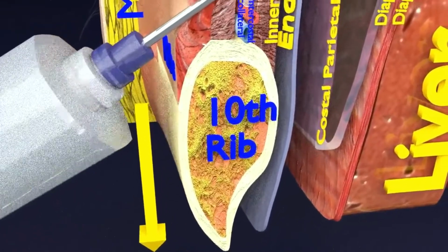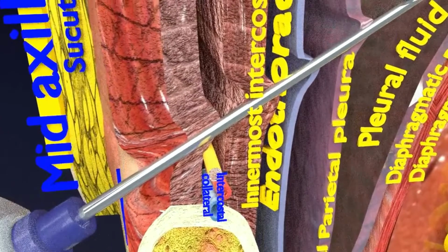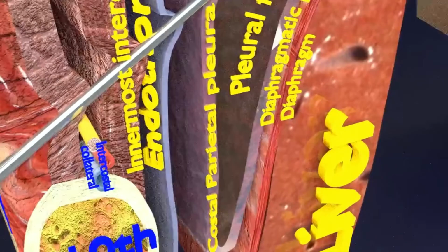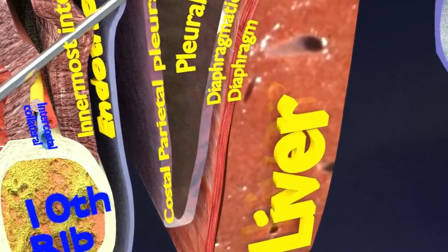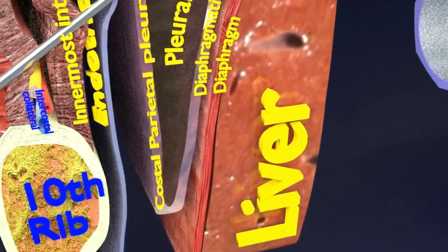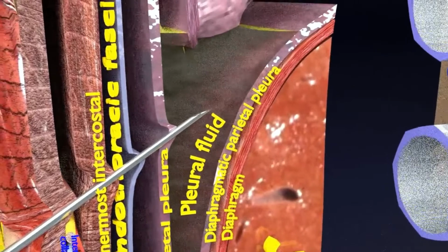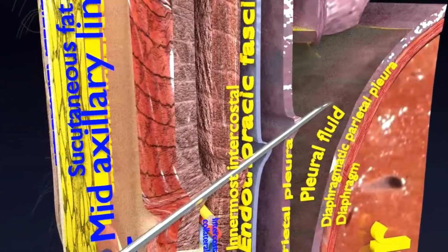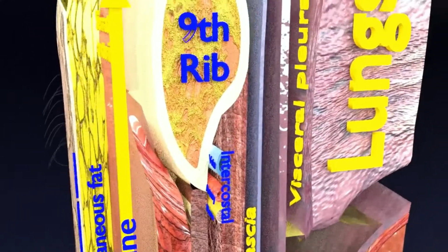To start with, usually an imaging test is done to look at how much fluid is around the lungs. This may be a chest radiograph, a chest ultrasound, or a chest CT to evaluate the location and quantity of the PF or pleural fluid. The skin of the puncture site is cleaned with a disinfectant before the needle is inserted. A local numbing medicine, an anesthetic, is injected into the skin.